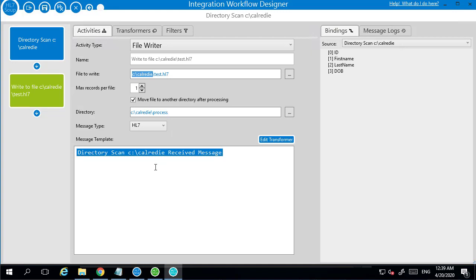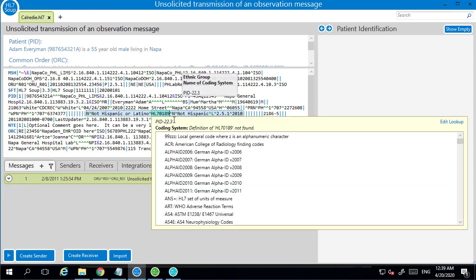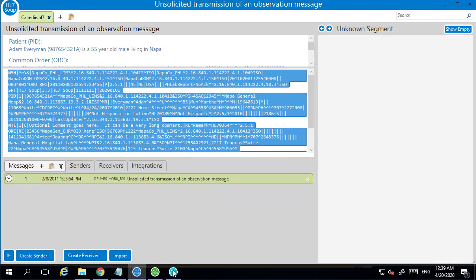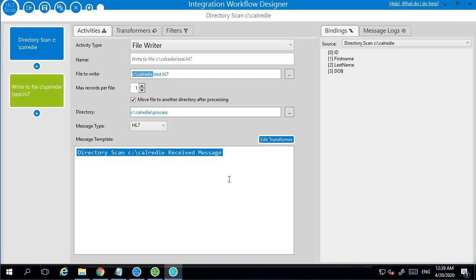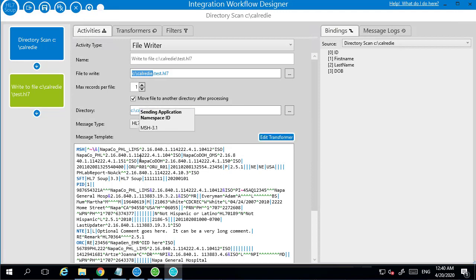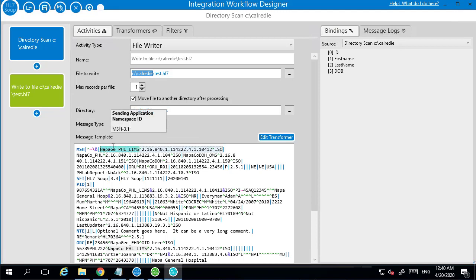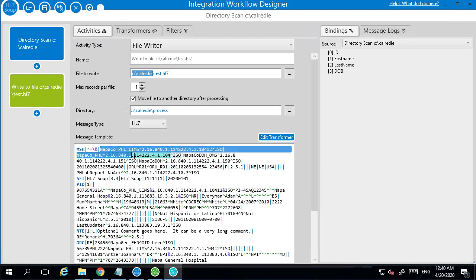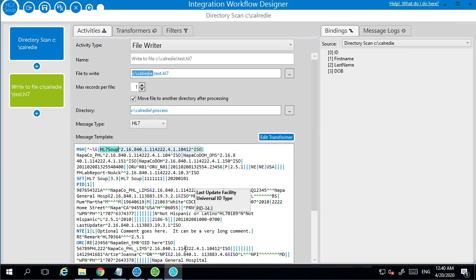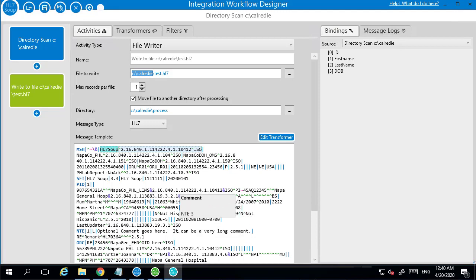We've got our HL7. So now we want to grab this message, copy it, back into here. I'm just going to place this in as the message template because this is effectively the message that we're wanting to write into that directory, this is the HL7 message. And many of these fields are actually going to stay the same. Many of them are literal values. So you can actually go into your sample value and you can put in whatever values suit. You can put in all your literal values that you've got that don't change per message into here.